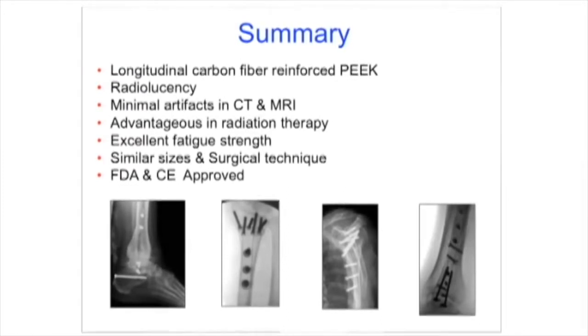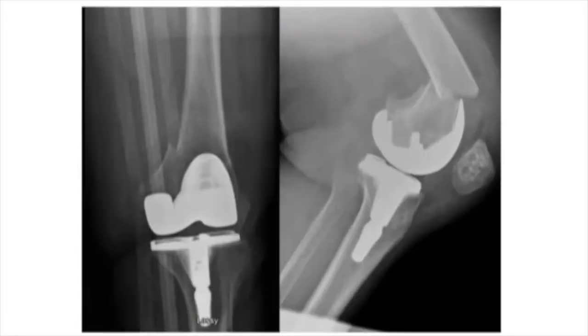And so I'll put a locking screw in there to kind of lock up the reduction, okay? But the problem that you get with metal implants is that it makes it too stiff. And if you look at the literature from a lot of the groups that do this and study it, they show that they develop a non-union because of that reason.